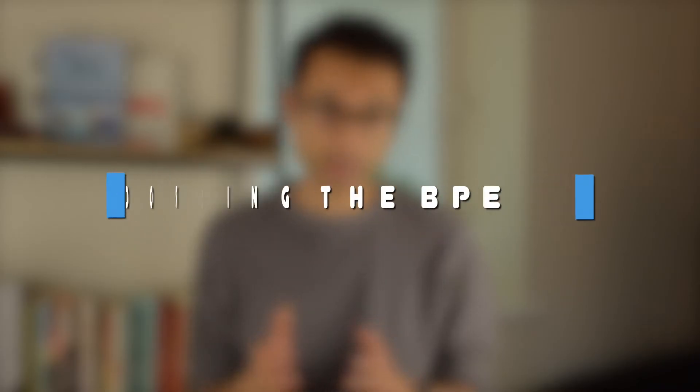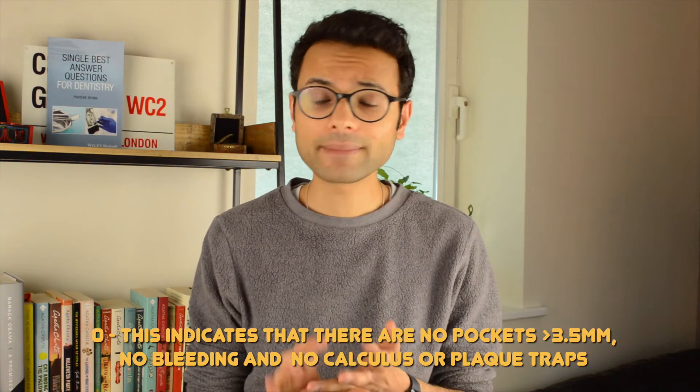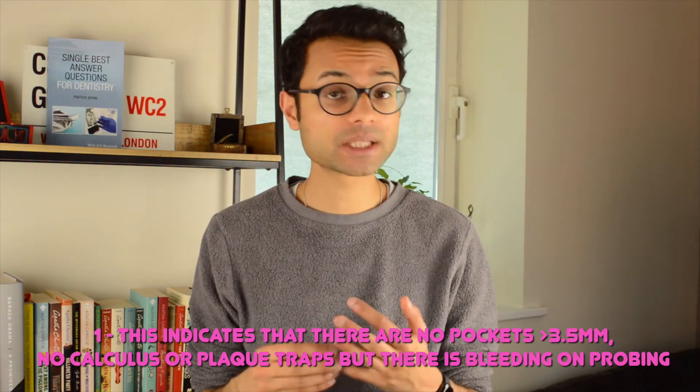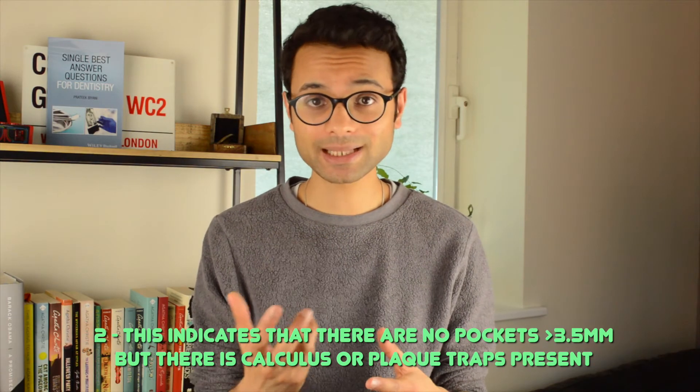In terms of recording the BPE we have several scores that help us direct periodontal management for our patients. In adults, a score of 0 essentially means there is no pocketing, no bleeding, and no plaque retentive features — a relatively healthy dentition. A score of 1 indicates some bleeding upon probing but still no pocketing or plaque retentive features. A score of 2 indicates no pocketing, however there are plaque retentive features such as overhanging restorations or calculus. In scores 0, 1, and 2, there is no pocketing evident and the first black band of the BPE probe between 3.5 and 5.5 millimeters would be fully visible.